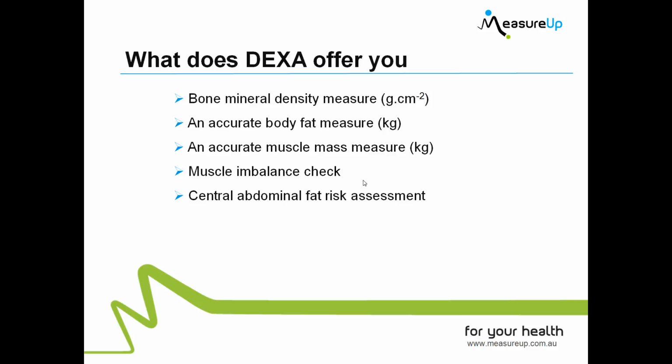DEXA provides you with bone mineral density measurement, an accurate body fat measurement, an accurate muscle mass measurement or lean mass measurement, muscle imbalance check, and a check of your central abdominal fat, which is essentially a risk assessment or an estimate of what is called visceral fat.